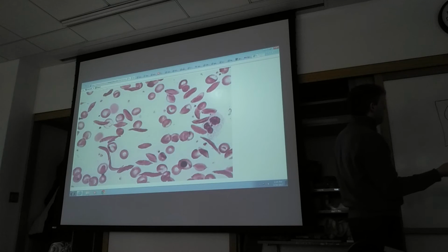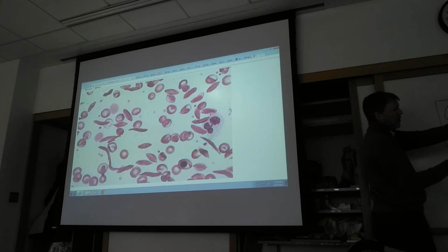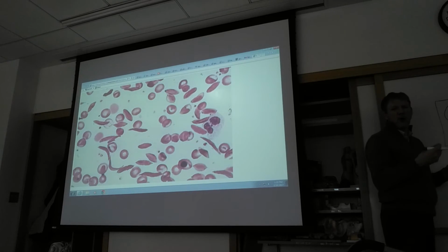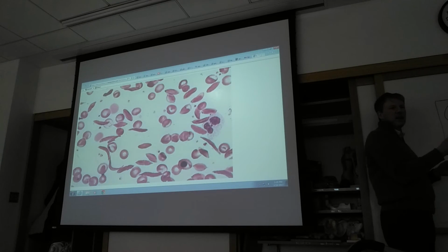So how does it work? Suppose I put someone's blood in here, and you give these different chemicals, and then you're going to look for what's called clumping or agglutination. If the particular marker is present on the patient's red blood cells, when you give one of these chemicals, it'll cause clumping or agglutination in that particular spot. If the particular marker is not on the surface of the red blood cells, you won't see any of that clumping.